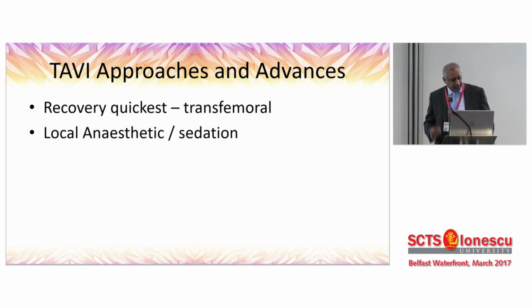I think overall we will find that the transfemoral approach remains the approach of choice. It's the quickest recovery. Most of these cases are done under local anesthetic and sedation, and most patients, if they don't need a pacemaker, will probably go home on day 2, day 3, I would think.